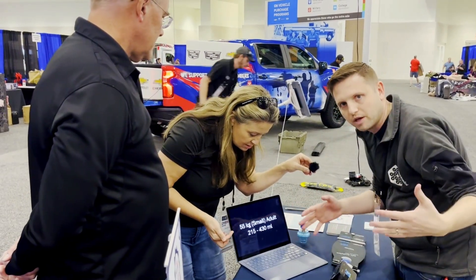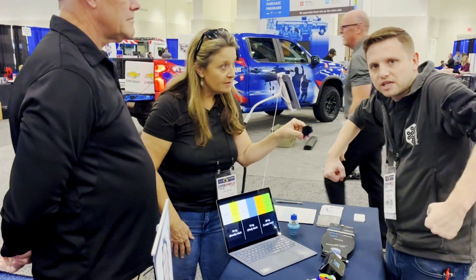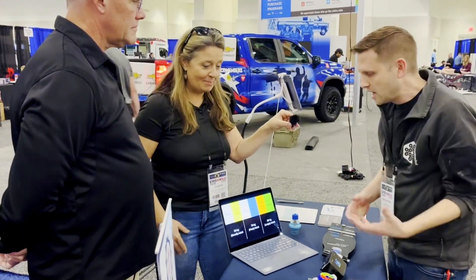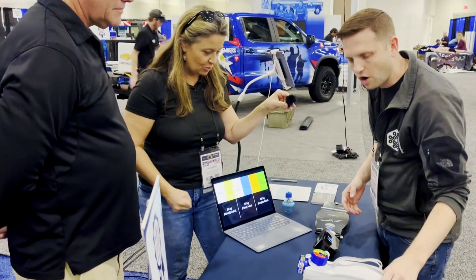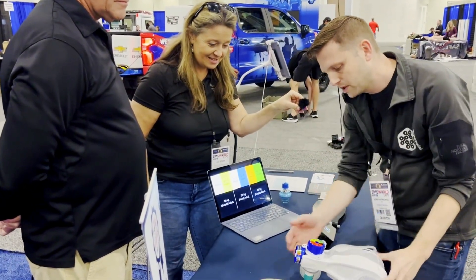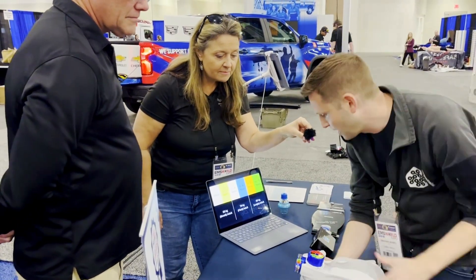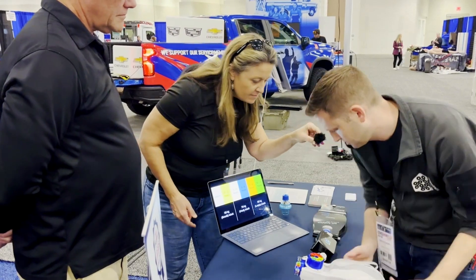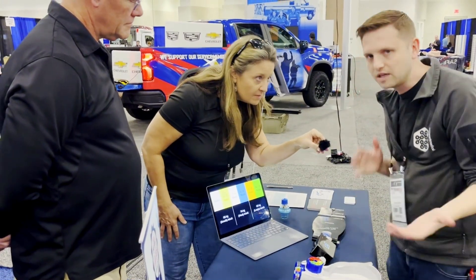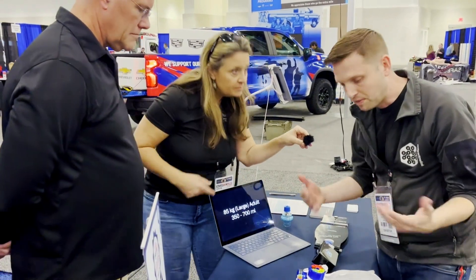What's cool is we tell people the biggest, burliest guy on your ambulance is not going to be able to go much higher than that. Now if you need more volume, you can go up on your volume or up on your PIP. If I set this all the way up on max, I can get right around 670 to 700 milliliters, which is right where you'd need to be for a large adult.